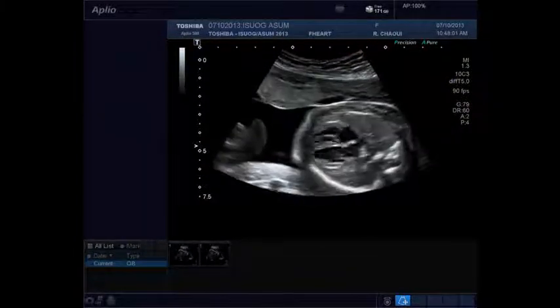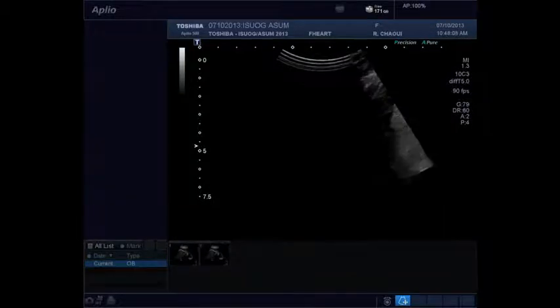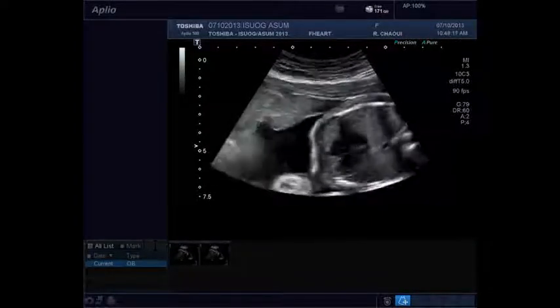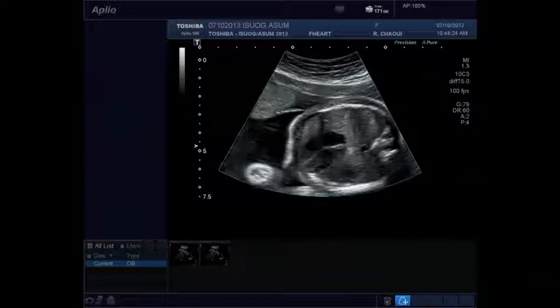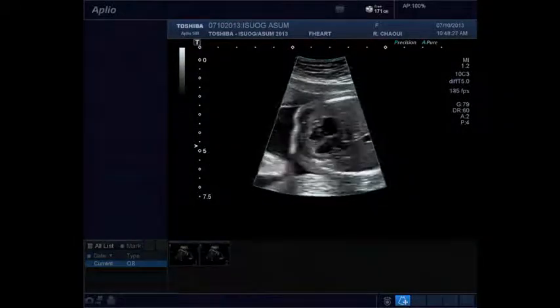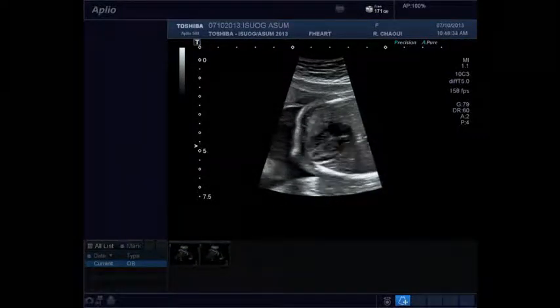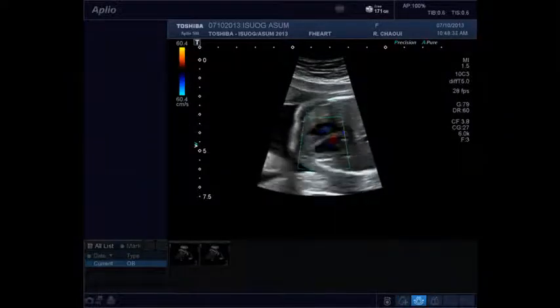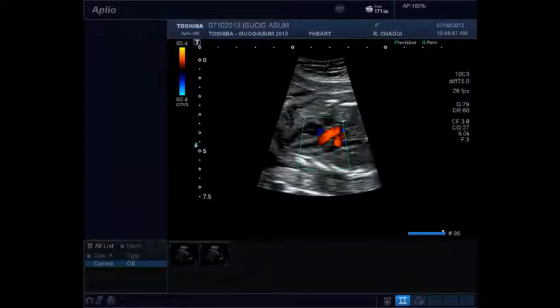Well, there is a debate on whether we should do routinely pulse Doppler on every valve. And we had this discussion when we were writing the consensus of fetal echo published in the White Journal. Let's say, in my opinion, if you are working on this fetus and you have a homogeneous flow, laminar flow on color Doppler, with HD, with dynamic flow, it could be problematic because you may not see clearly some turbulences, but let's go for color Doppler. If you have this kind of flow, I don't see where there is a space for pulse Doppler to see any abnormality.